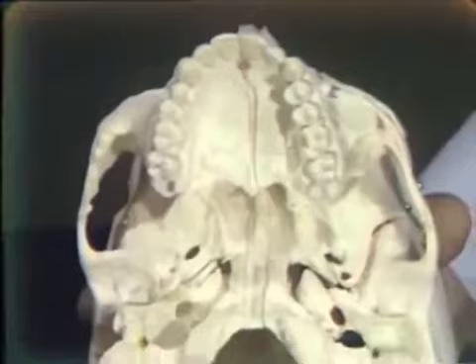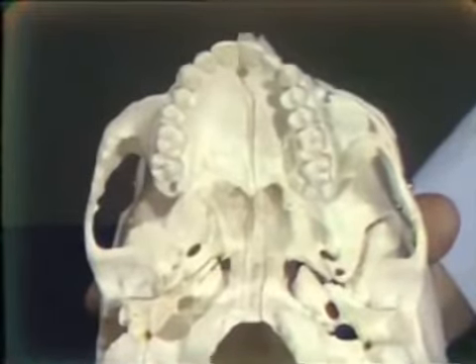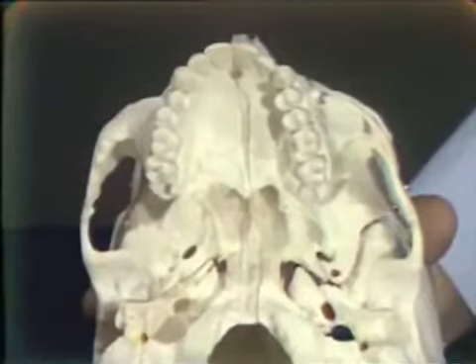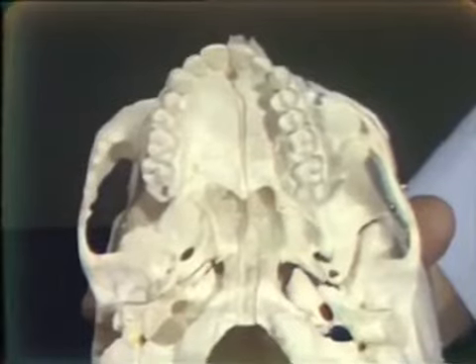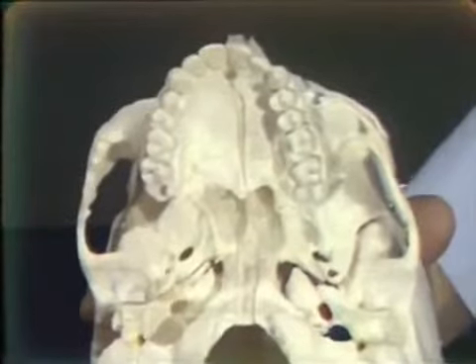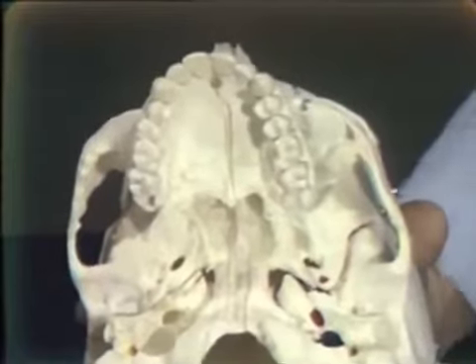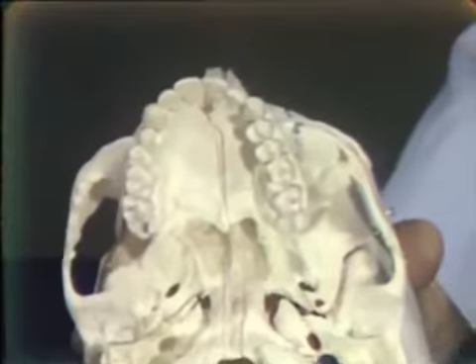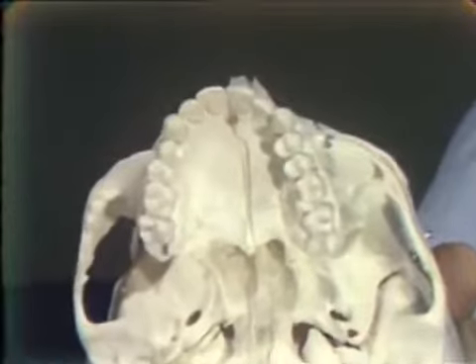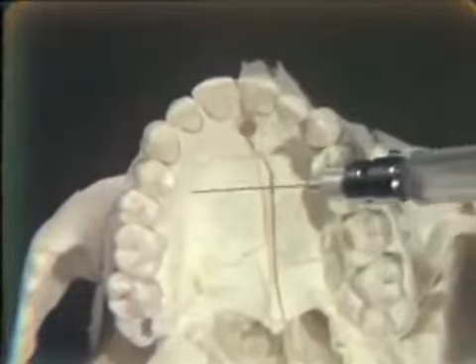Now on occasion, you may just be carrying out instrumentation on one tooth or removing one tooth. It isn't necessary to block the entire anterior palatine nerve, and we can infiltrate just palatally to the tooth in question and so-called get a partial anterior palatine block. Let us suppose we were going to remove this maxillary first bicuspid. It wouldn't be necessary to give the anterior palatine block, but just simple infiltration about 1 centimeter from the gingival margin on the palatal side of that first bicuspid in such a fashion as this.